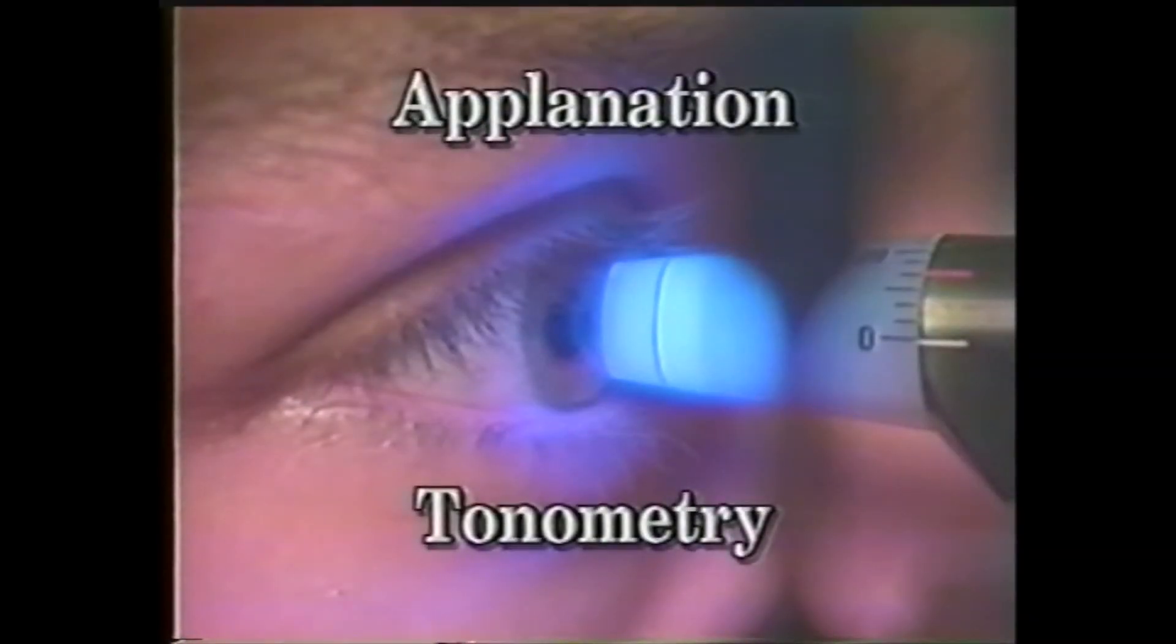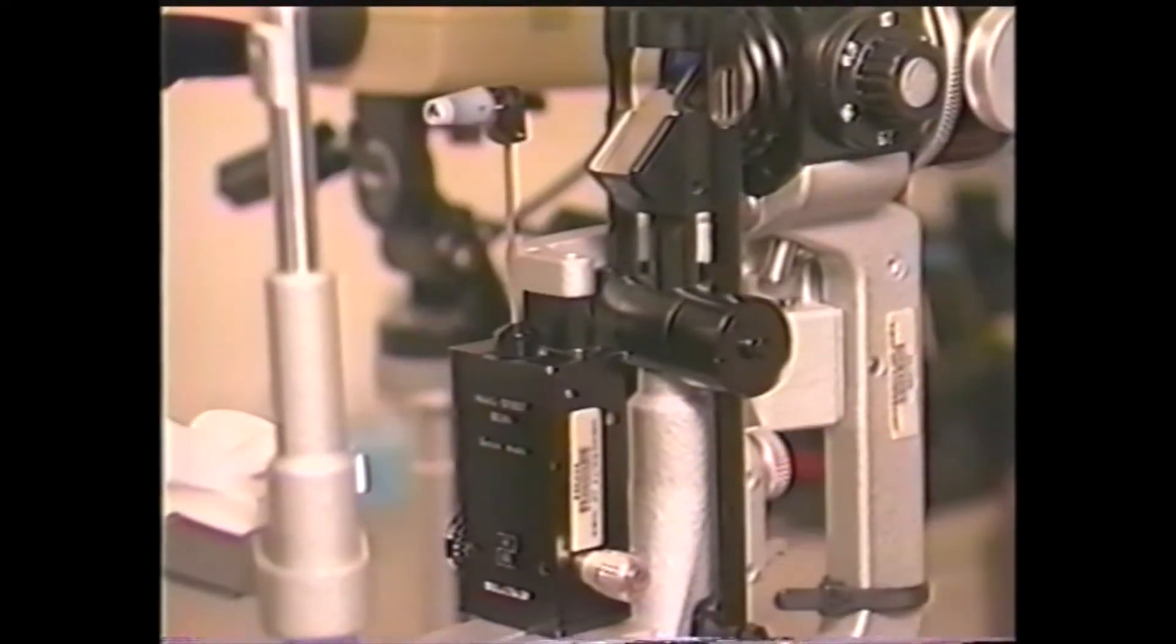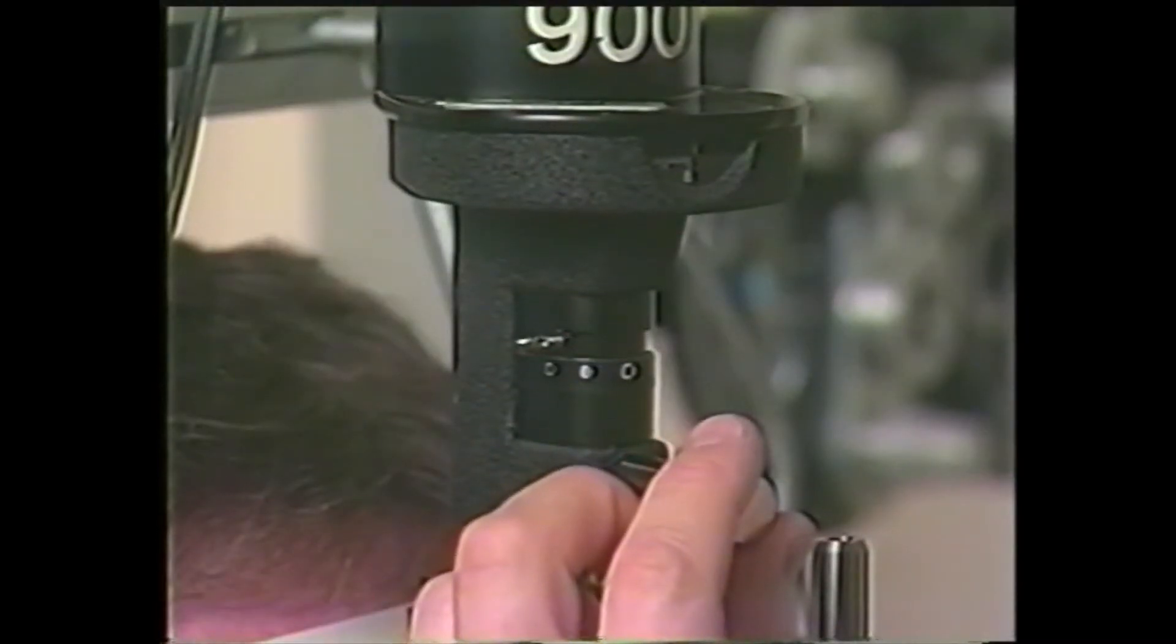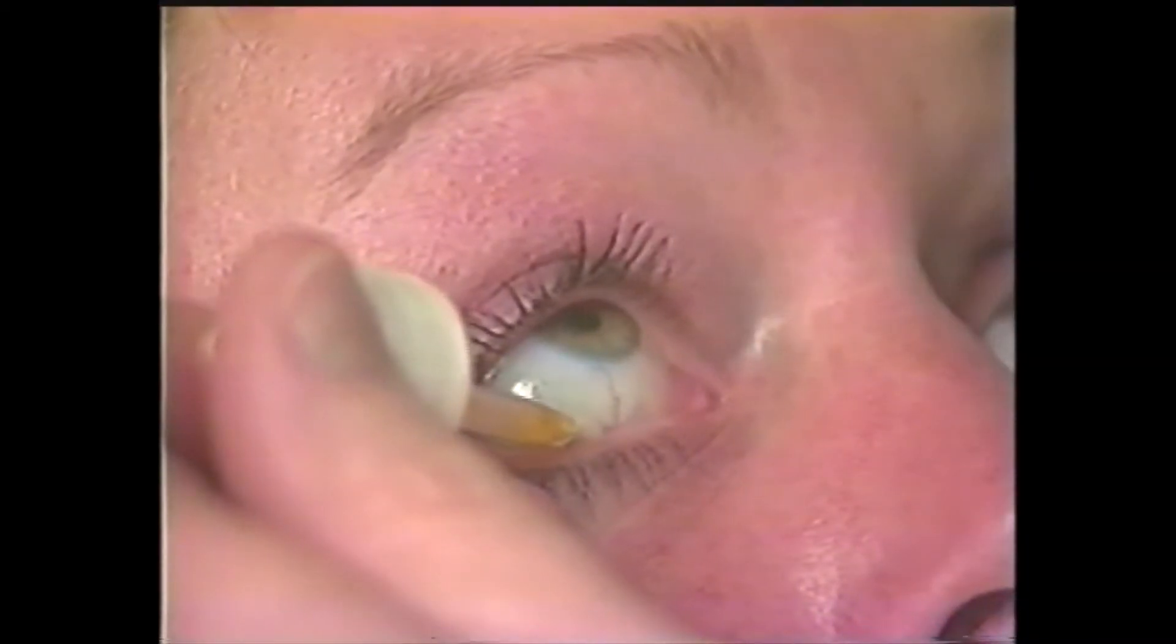Applanation tonometry should be performed after the anterior segment examination. Place the tonometer in position, insert the blue filter in the slit beam path, anesthetize the eyes, and instill fluorescein.